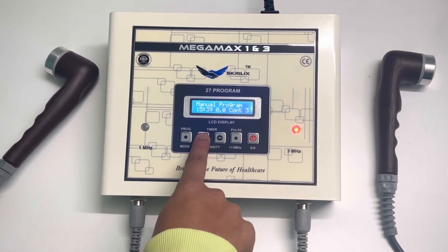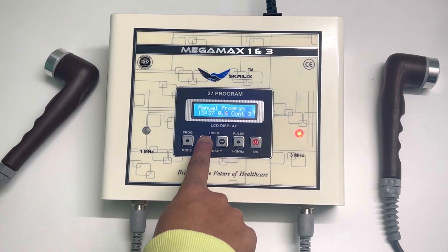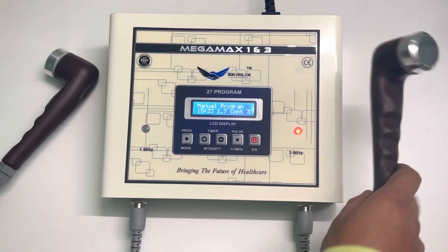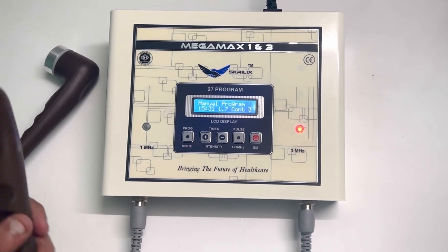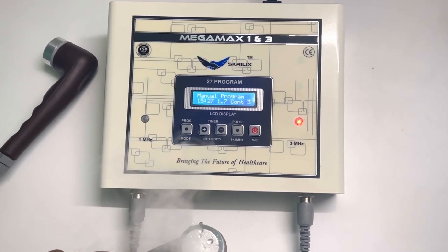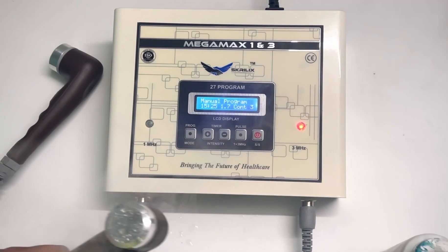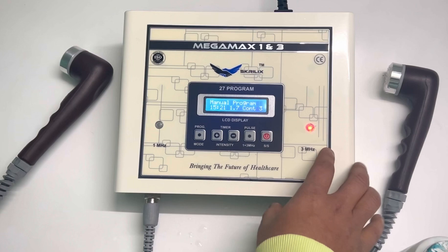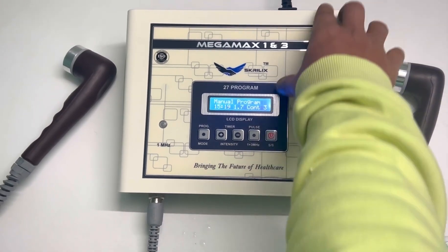Start increasing the intensity — this is the 3 MHz flow, as you can see it starts working. For more information, you can visit our website. Thank you.